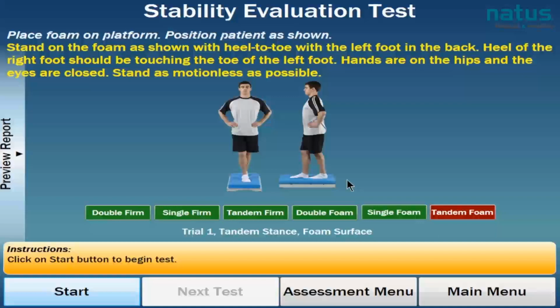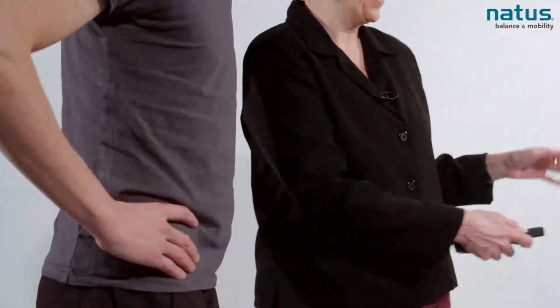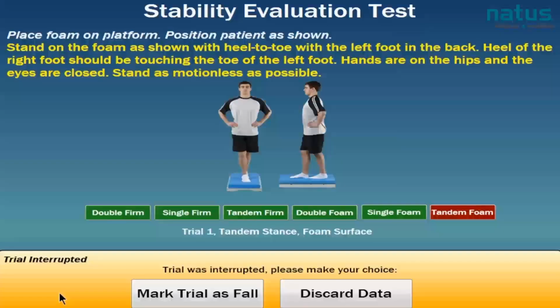When you're ready, close your eyes. And I hit the start button, and he's fighting, fighting, fighting, fight for it. Go, good work. Good, that was good. You were fighting, and that was exactly appropriate. We'll do one more trial of this, okay? I'm going to discard that data.